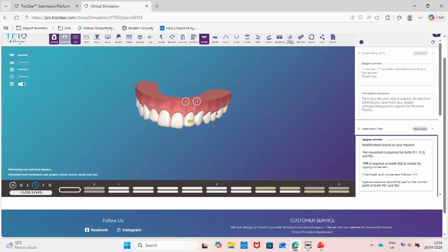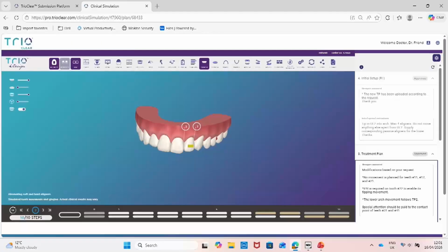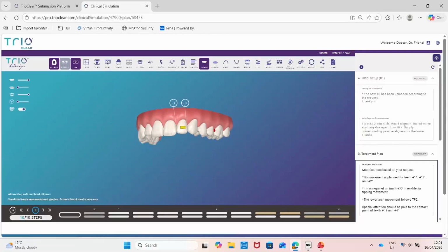Those lower incisors came across in one plan, so that was in total, because these last two were blank aligners, those lower incisors decrowded in 8 aligners. And actually we can see here, just in my notes, we are just having to do a slight refinement on the upper left 2. It didn't quite squeeze in. I would probably blame my inadequate IPR on that not squeezing in fully. I was probably shy on the IPR, which is why that didn't come across in one plan.